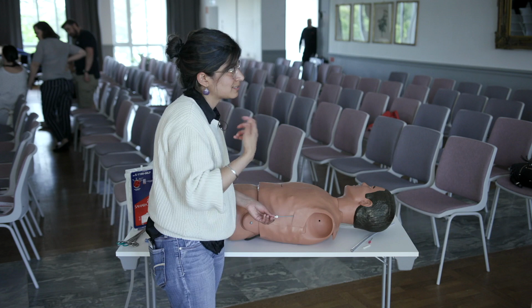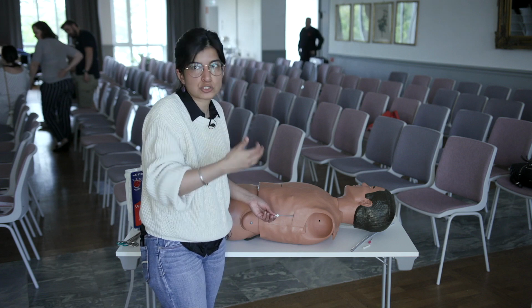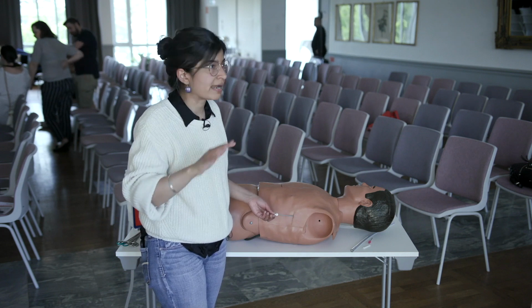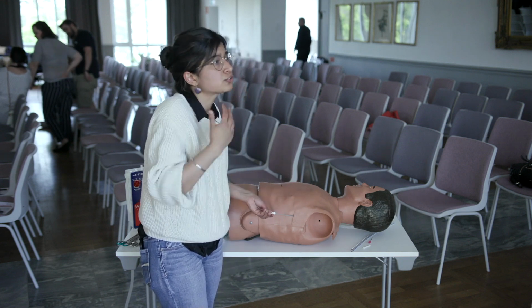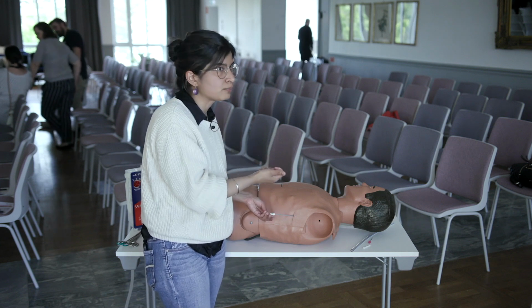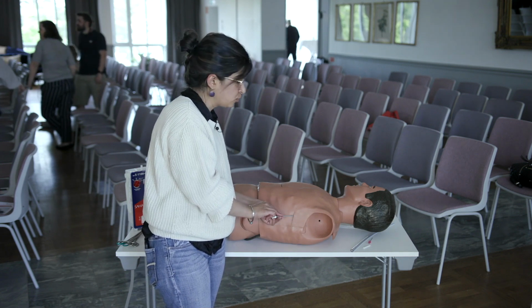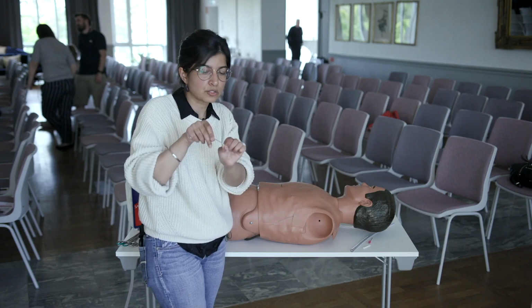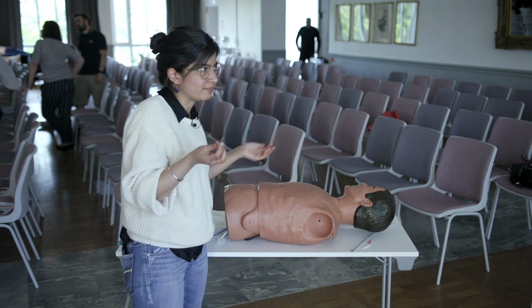And then sometimes in really muscular people, this can be forceful, right? But never push something procedurally. Central line, A line, chest tube, drain, whatever you're doing. If you are having to put your back into this procedure, you're doing something wrong and you're hurting your patient. So you either need a bigger nick, or you need to dilate more. And the reason that's really important is, remember I said everything is about the integrity of your line. So if you push really hard, these dilators are pretty pliable also, right? So it bends in your skin and it bends the wire. Once your wire is bent, you've already lost. You kind of have to start over.